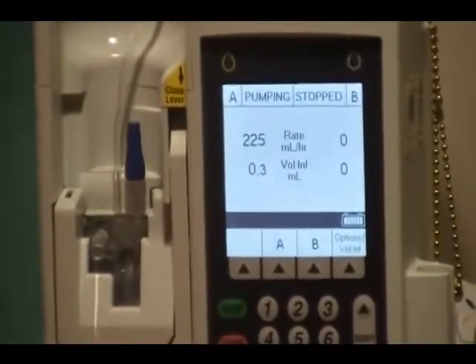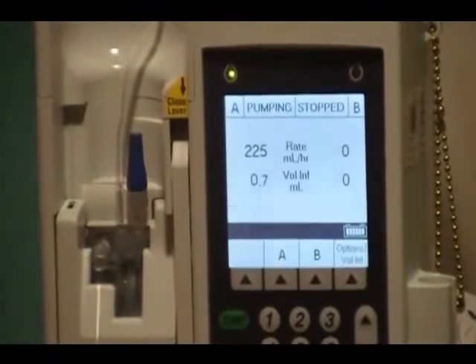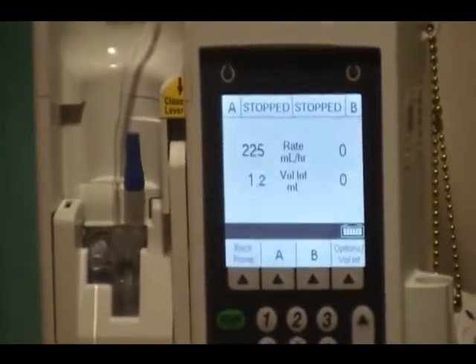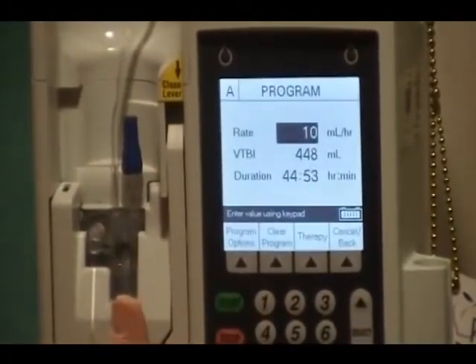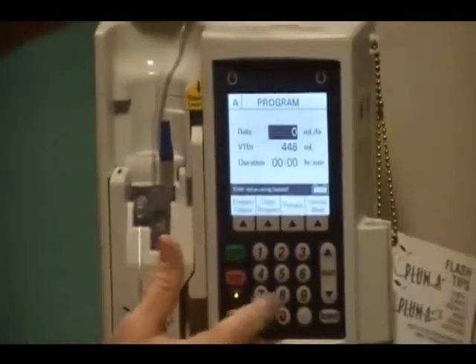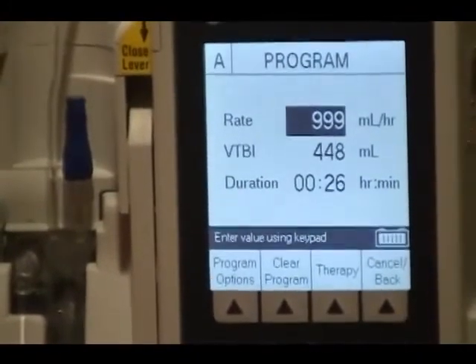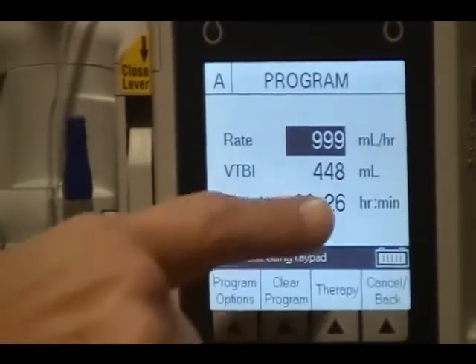Student question: Does that mean the pump won't let you program a time that's inappropriate for the volume? Exactly — 999 is as high as it will go, so the pump helps you stay compliant with the parameters of what's allowed. On Line A, I'm going to change that rate and try to enter 1000 — no, it won't let me. So 999 is the maximum. Now, my question is: if I know the volume and the rate I want, will it automatically calculate the duration for me? Yes — and it goes both ways. If I want the rate, it will automatically calculate that too.